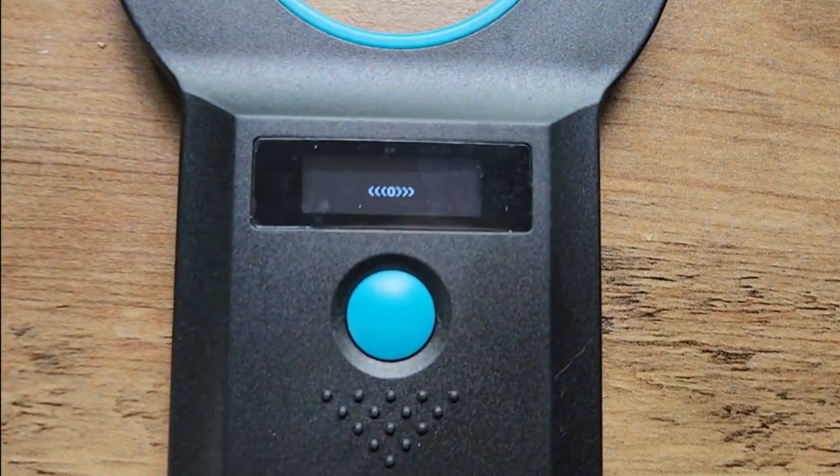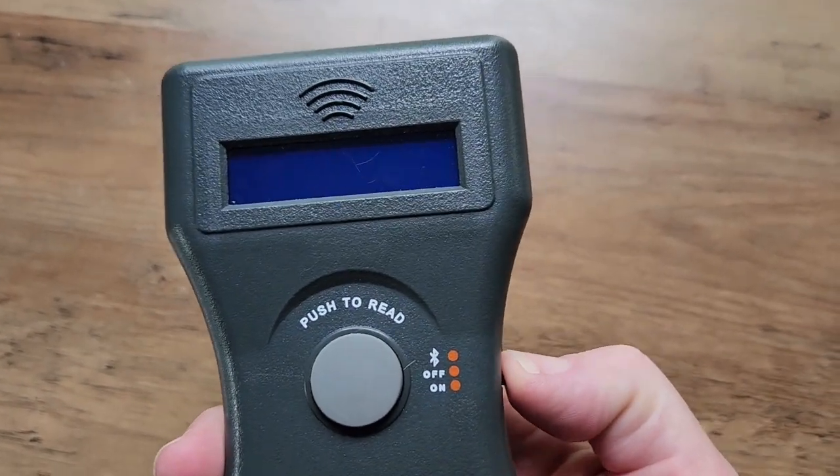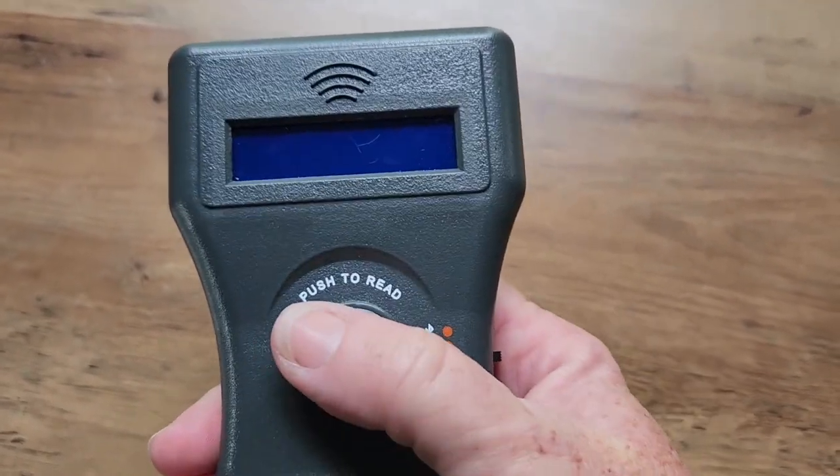We're going to start with step one, which may seem obvious but isn't: make sure the scanner is turned on. Every scanner is different. Some will turn on when you push the button — you'll hear a beep and see something on the screen indicating it's in scanning mode. Others, like the Hero, which is the premium scanner I use in my business for microchipping and checking animals, require you to turn it on with a toggle switch before pushing the button to scan.